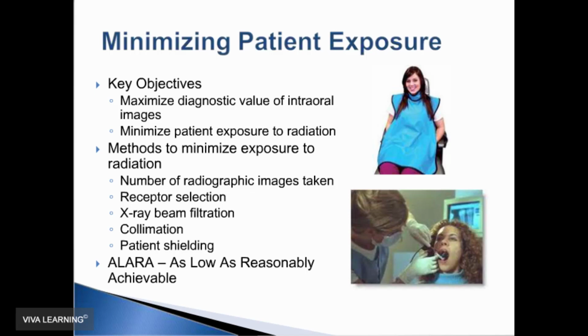So it is their responsibility to make sure they use high-quality techniques and keep the exposure to the patient as low as reasonably achievable. There are a variety of methods that you can employ to reduce exposure to patients: the number of radiographs taken, the receptor that you choose, the filtration of the X-ray beam, beam collimation, and patient shielding.